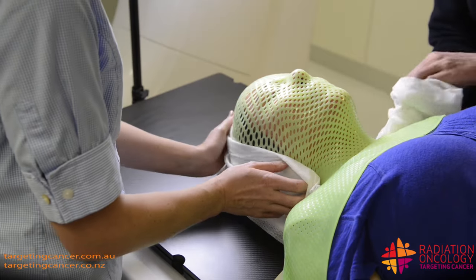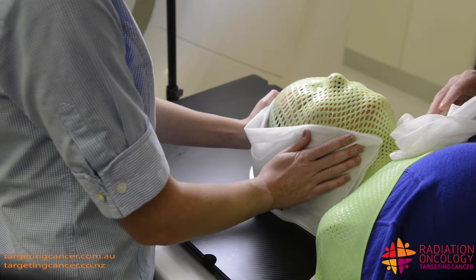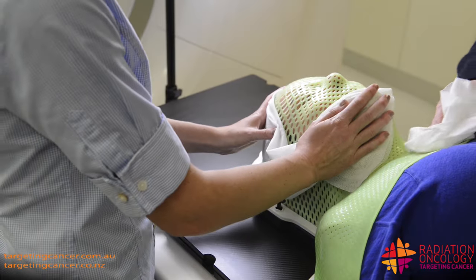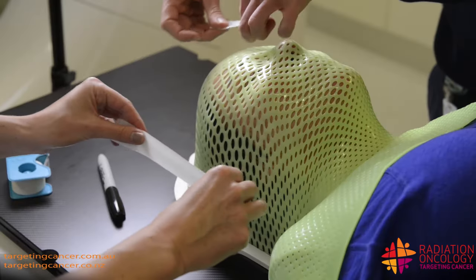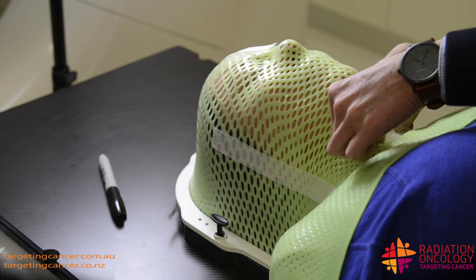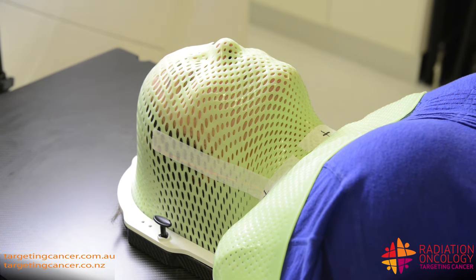So in just a moment, we're going to be using our laser systems to put reference markers on there, which helps us with the planning process. It's all calibrated to coincide with the treatment lasers in the treatment room. So I'm just popping those reference markers on. Just stepping outside the room now — we're just going to be doing that scan. Breathing normally, we'll be back in in just a moment.